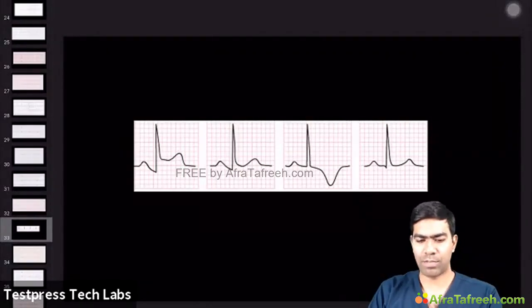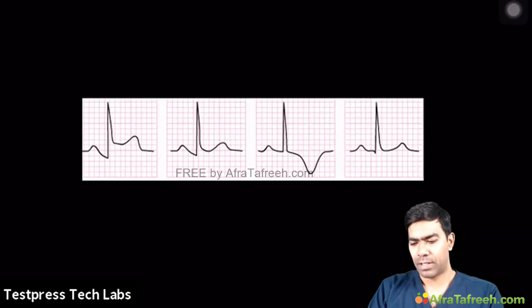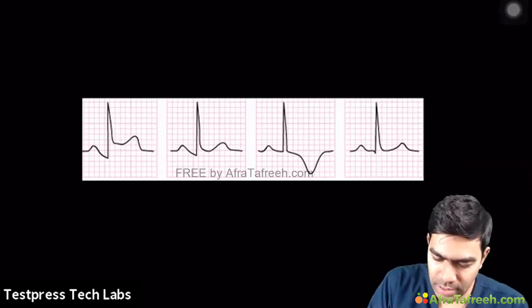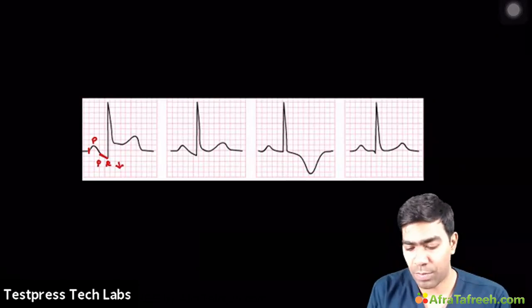Yeah, these are stages of progression. What are the classic findings of pericarditis? So you can see this is the P wave and this is the PR segment. And you can see the PR segment is depressed. That's very classic of pericarditis.